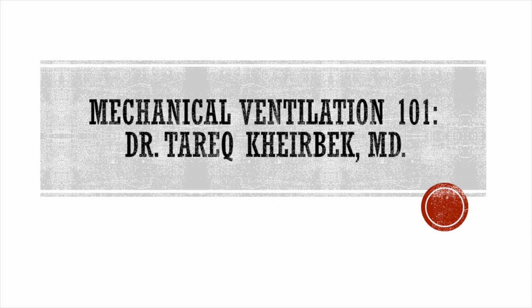So in somebody who is a 70-inch tall man, their ideal body weight will be around 70 to 75 kilograms. So if I want to choose 6 mLs a kilogram, that will end up being a target tidal volume of 420, maybe 450, which will be a safe tidal volume. Now I said that my minute ventilation in a septic shock patient would be between 8 to 10.